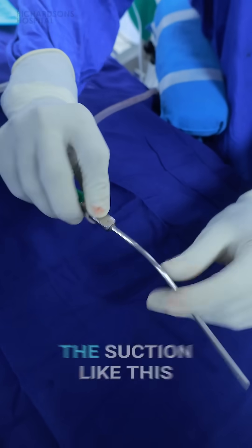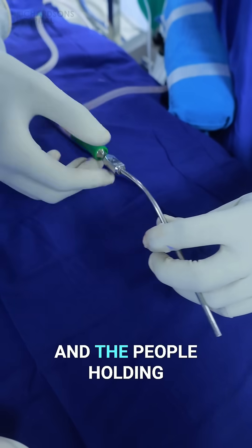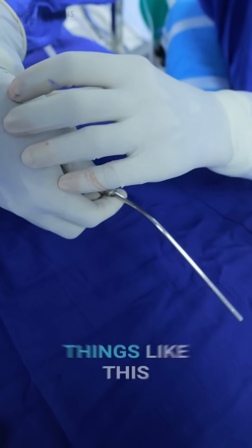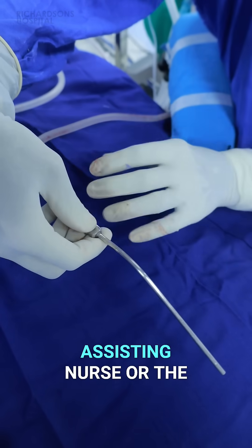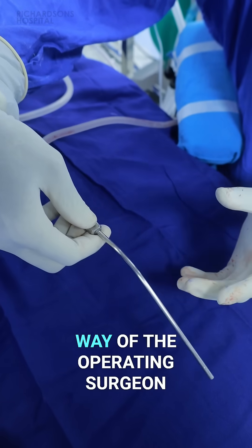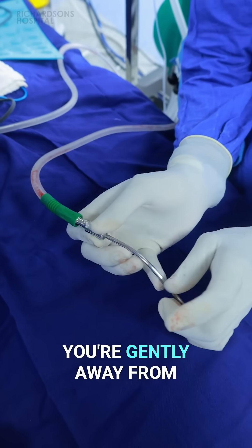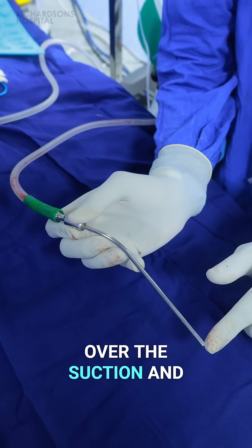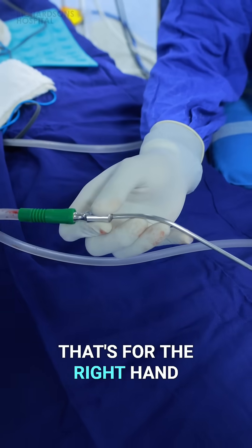I've seen people holding the suction like this, which I don't think is a good idea at all. Then there are people holding the suction from the top — not a good idea at all — because when you do things like this, the hand of the assisting nurse or surgeon comes in the way of the operating surgeon. By doing it correctly, you keep gently away from the field, you have full control over the suction, and you're able to deliver the exact amount of pressure you need. That's for the right hand.